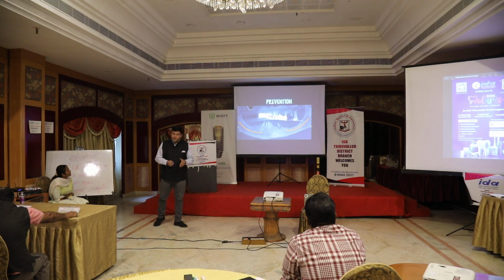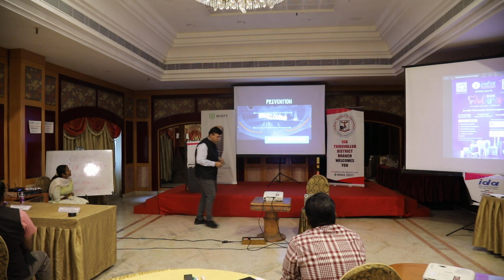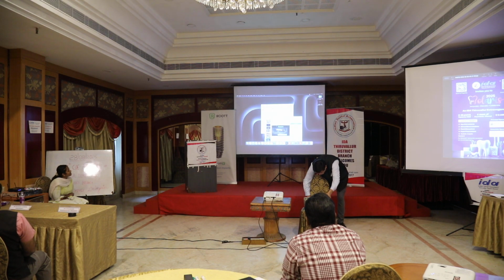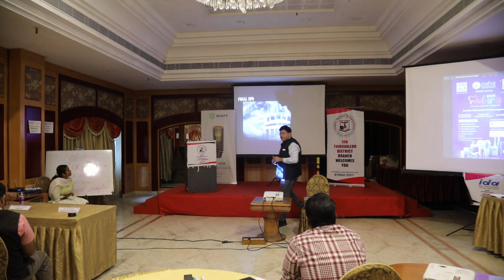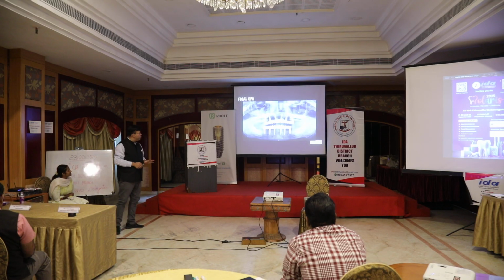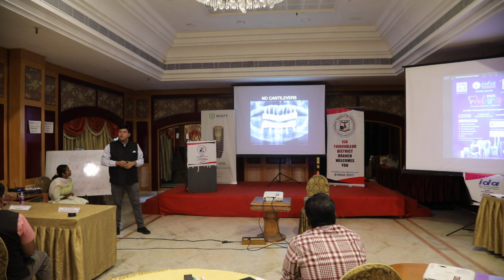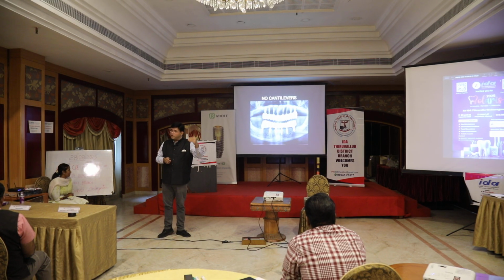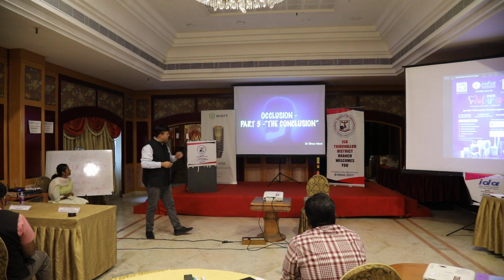Right? When you do a guided workflow, we will not go with the entire surgery, but I will just show you how the guided workflow will give you the end result. That is the same case when we do it in a guided way. No cantilevers, absolutely. Another similar situation, no cantilevers. So guided or digital implant dentistry will help you in occlusion as well, because our implant positioning will be correct.